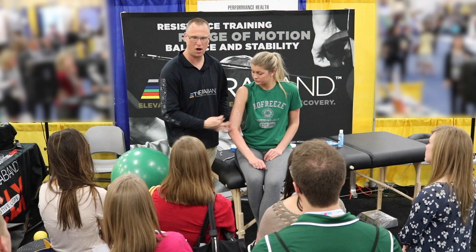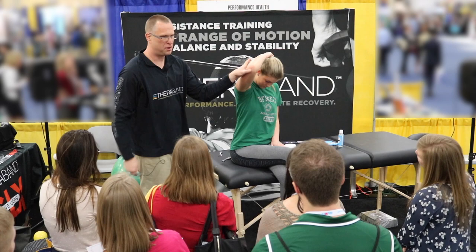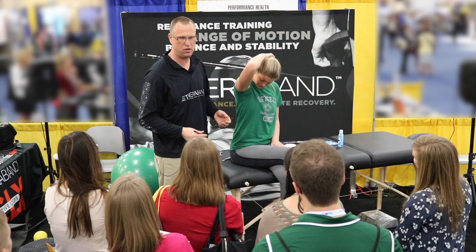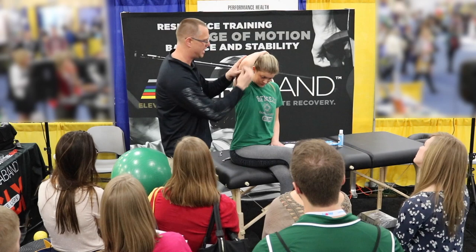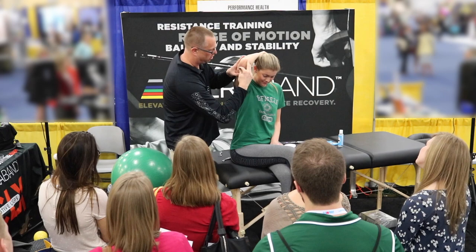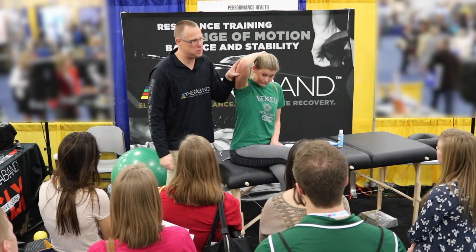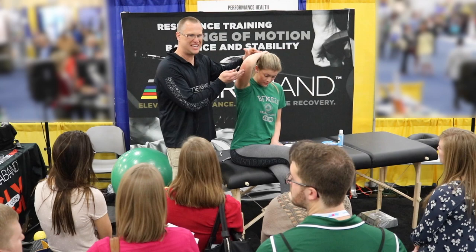Three targets for lateral epicondylopathy: common extensors is the no-brainer. The second target is the triceps insertion. Because of all the lifting and pushing activities we do, this area gets really gristly — collagen has been laid down there. I hold the instrument simply like a pencil, very light in my fingers, while tissue-tensioning with my non-instrumented hand. I work that triceps insertion — it's the area I think over 50% of clinicians forget about, and it's a major component to lateral epicondylopathy.